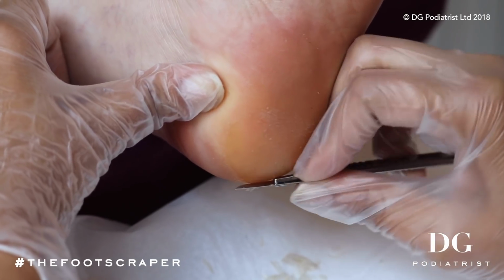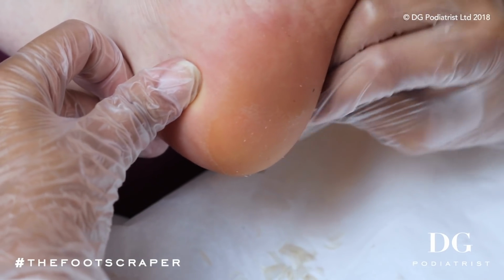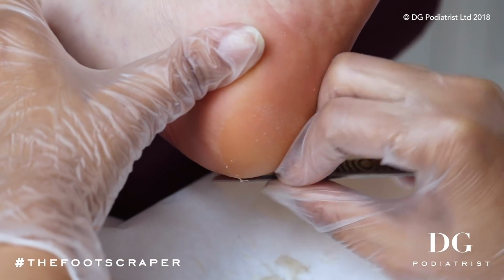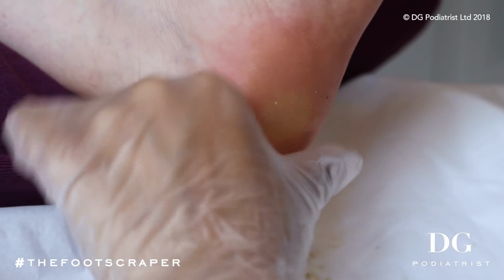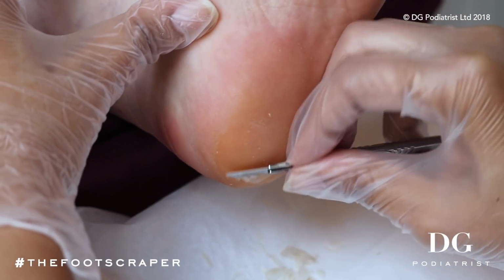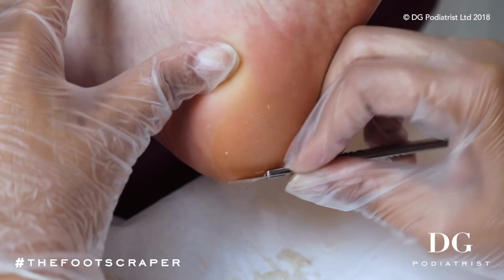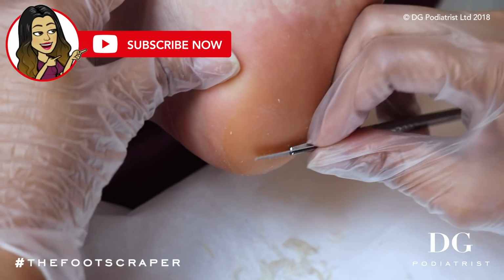How's that feeling? It feels lovely, yeah. Good. So that's actually feeling a lot better now. Cool. It's just a little bit left on the under part of the heel, which we call the calcaneus. I'm not sure if you've heard of that term before. Calcaneus. It rings a familiar bell from anatomy, but if you gave me a map of the foot and told me to point to the bone of the heel. Right. So for short, we'd normally class this as the calc. But in an easier term, it's just the heel. Okay. A lot better. I think why complicate things if you don't have to, right? Still a lot coming off just from underneath. Okay. So, much better. There we go. We are good.